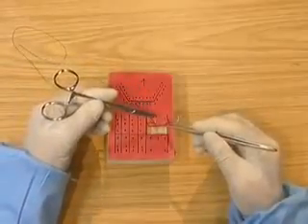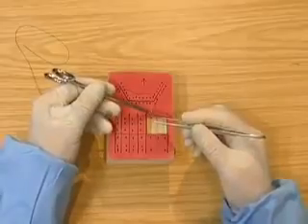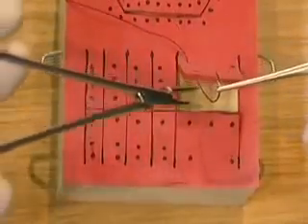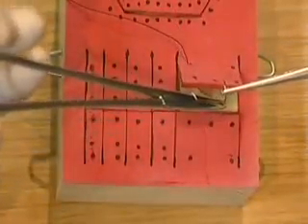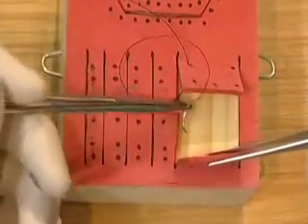Lift up the flap, go in at right angles, pick up the needle with the tissue pickups, change to the reverse grip, then pen grip.